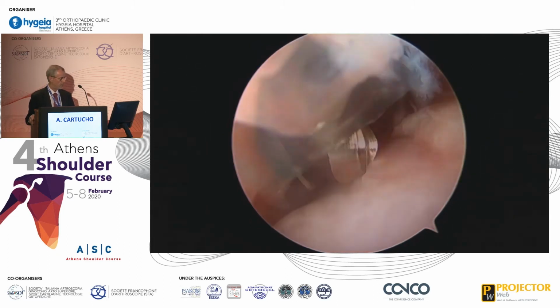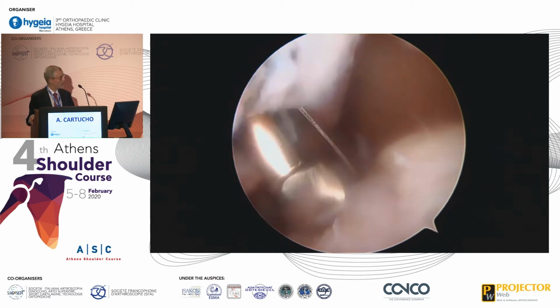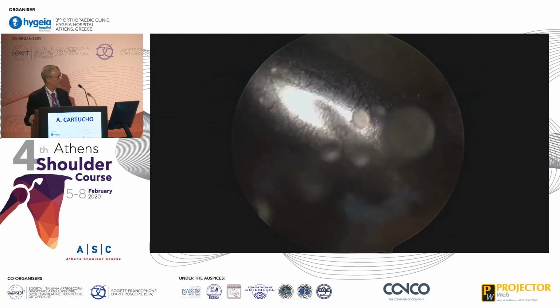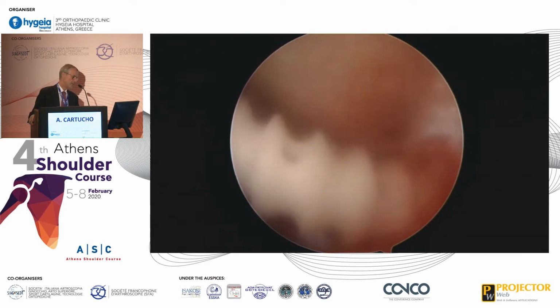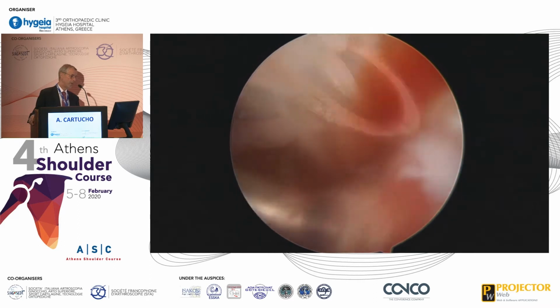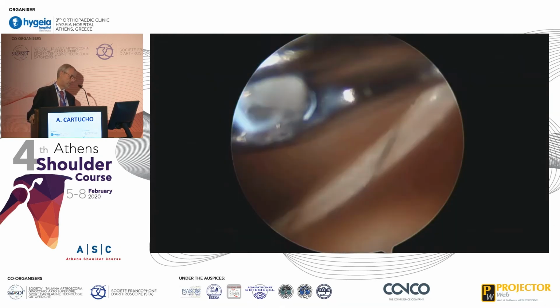I introduce my cannula, then I abrade my Hill-Sachs lesion. I'm not too aggressive because I don't want to make a bigger Hill-Sachs lesion. Then I use an anchor. You can use whatever anchor you want, but be aware that in young people, this part of the bone is very hard, so be aware not to break an anchor, and do it with a strong anchor.